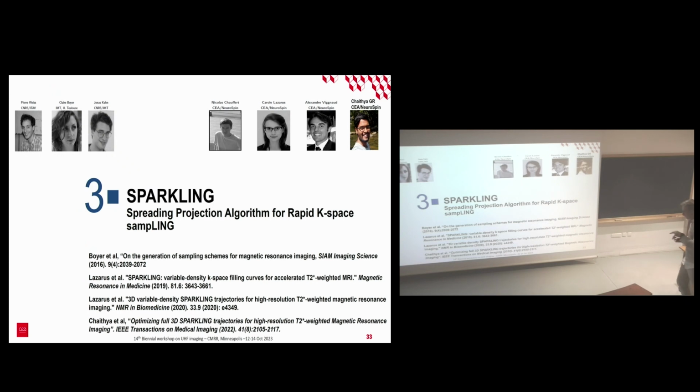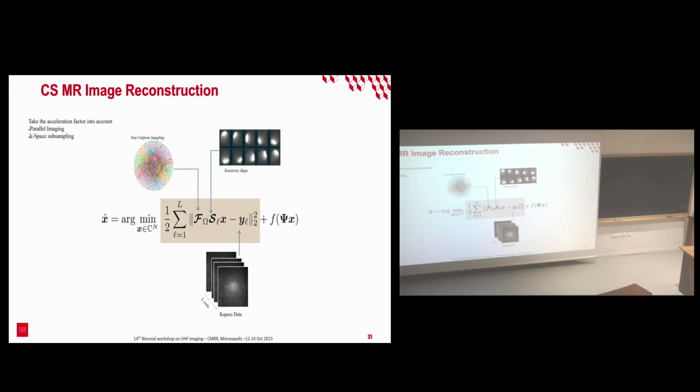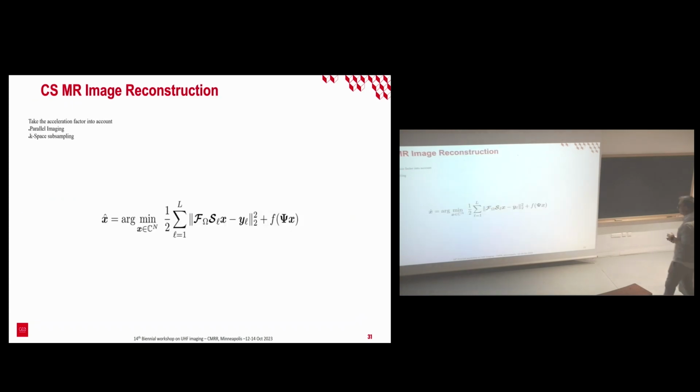So in regards to the optimization of the sampling pattern itself, I'm going to show you how to basically go beyond this part. Just because this approach is just considering existing and analytical sampling patterns, just undersampling over the sampling patterns. But we can do much better.